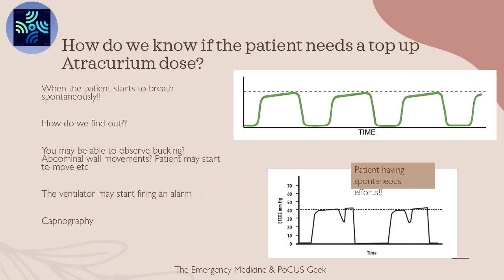How do we know if the patient needs a top-up atracurium dose? When the patient starts to breathe spontaneously. How do we find out? You may be able to observe bucking, abdominal wall movements. Patient may start to move. The ventilator may start firing an alarm. Capnography.